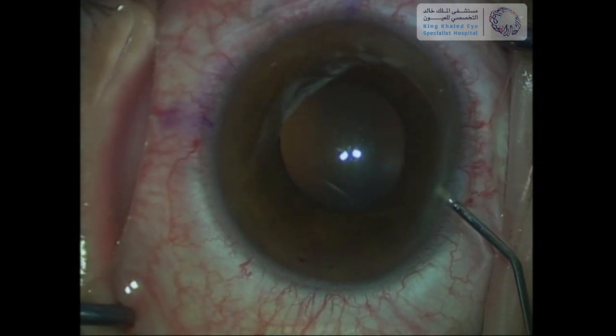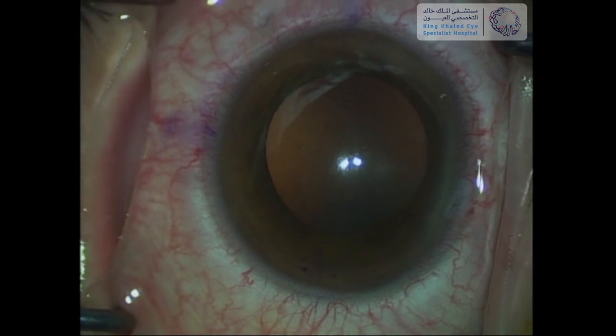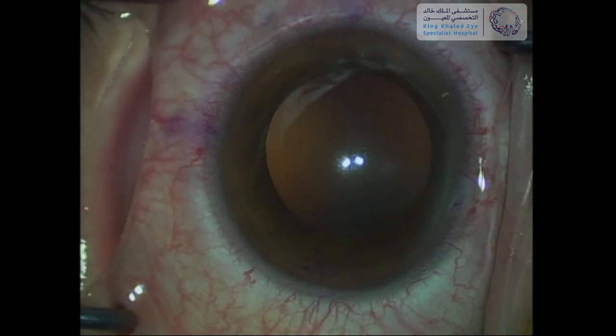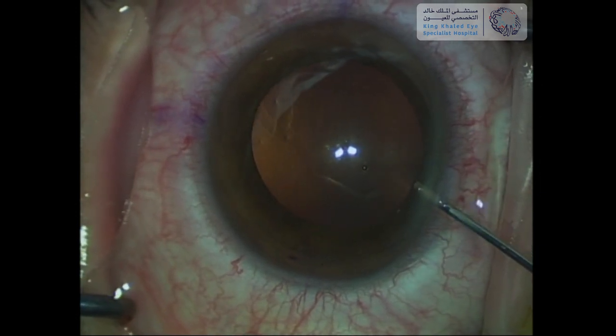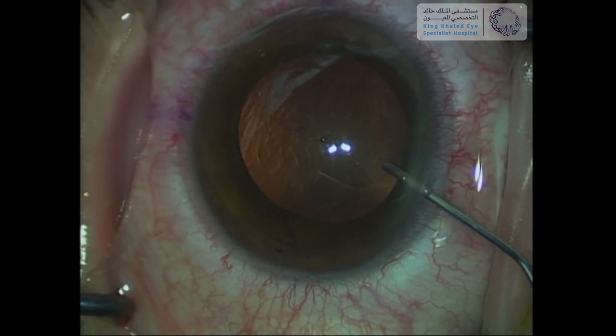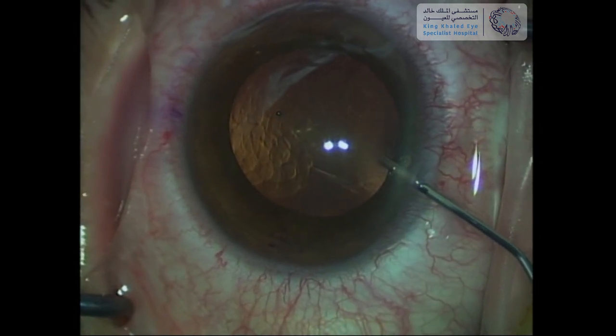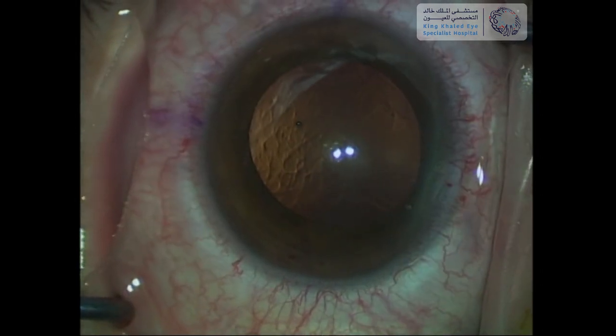This is followed by injecting lidocaine epinephrine to achieve appropriate pupil dilation. The anterior chamber is then filled with viscoelastic material. It is important not to overfill the chamber with viscoelastic, for easier removal after ICL insertion and to avoid IOP spikes post-operatively.